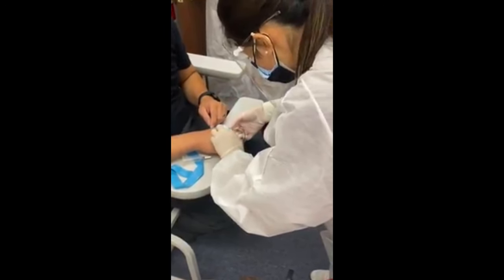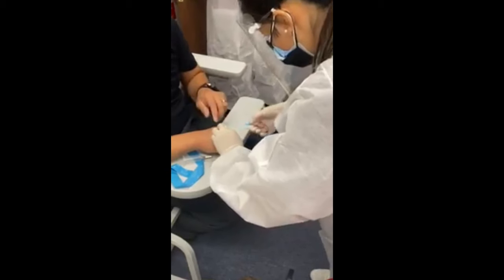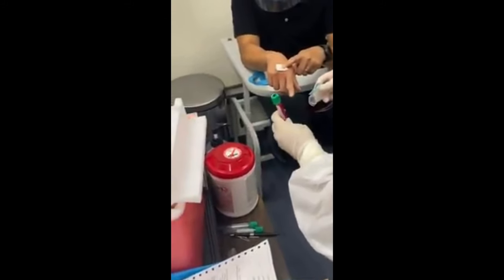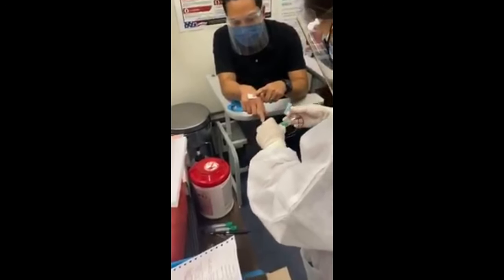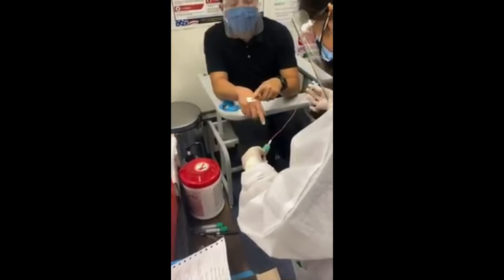Okay, so I'm just going to release the needle. Perfect, and then have me apply direct pressure. Please apply pressure. Okay, perfect. And then since there's blood in the line, you can actually get it from the line, so go and get your tube. And see if there's enough vacuum there, you guys can see it come out. Will it suction it? There. Yeah, it did. Yeah, there you go.